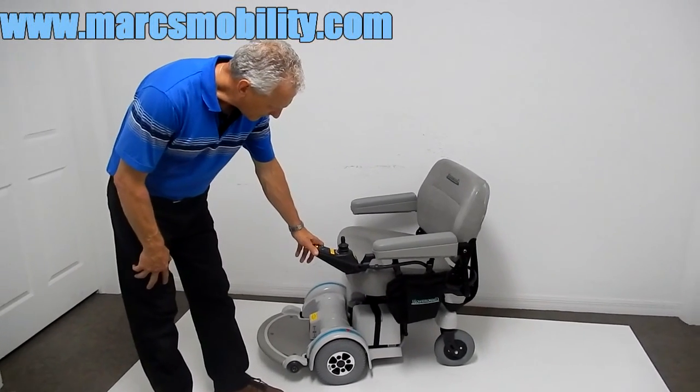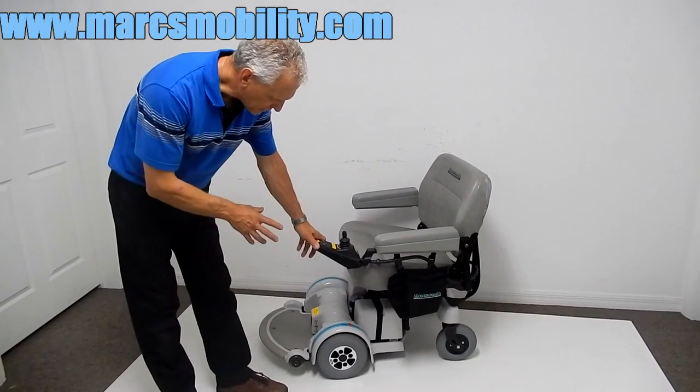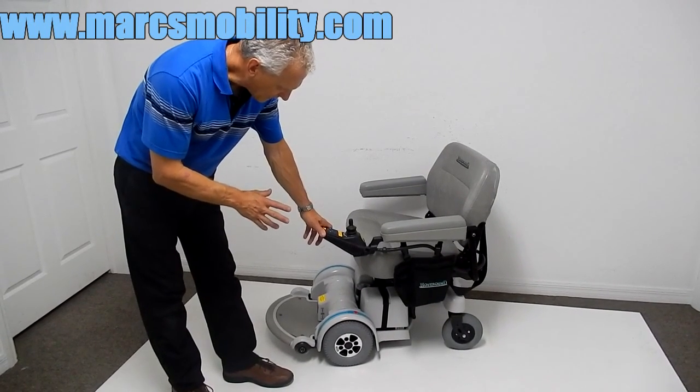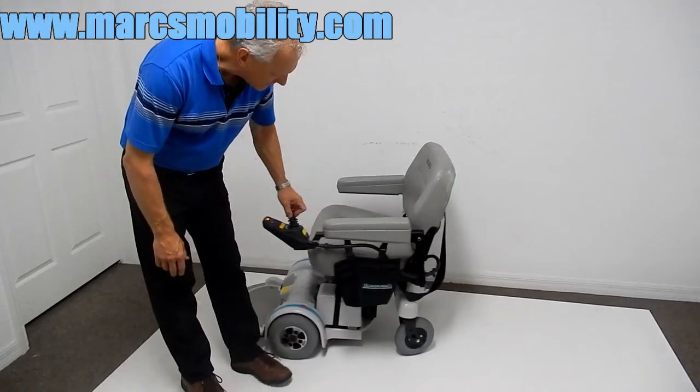This is a Hover-Round MPEV-5, and this power chair has the electric seat lift. This is a Hover-Round made in the USA — the only chair that's made here in the US.